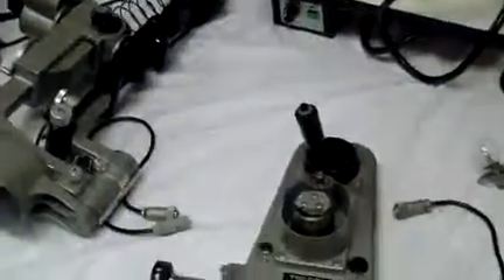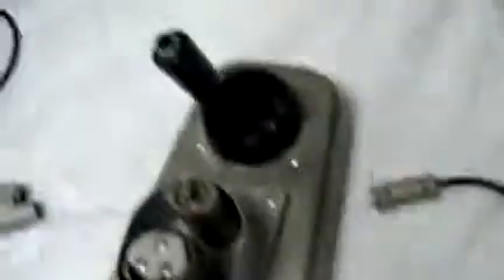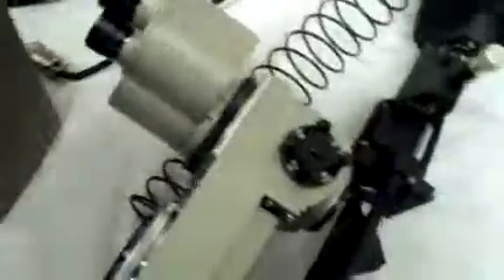All the parts are here, as far as I can tell. I haven't powered it on to see if it still works, but there's a lot of salvageable parts — the wheels, the handle control, the optics are still intact, as far as I can tell.